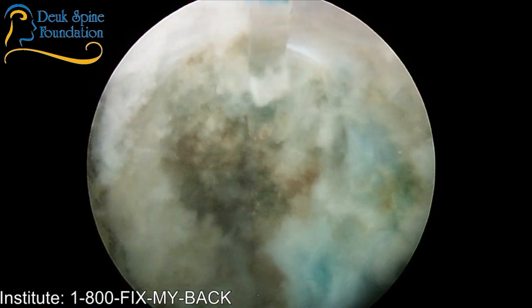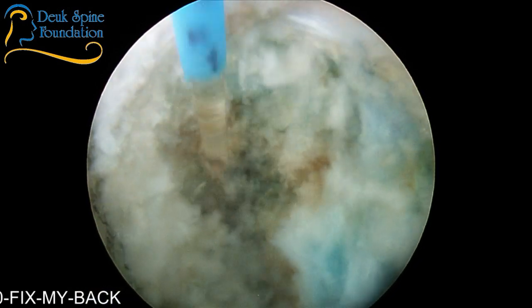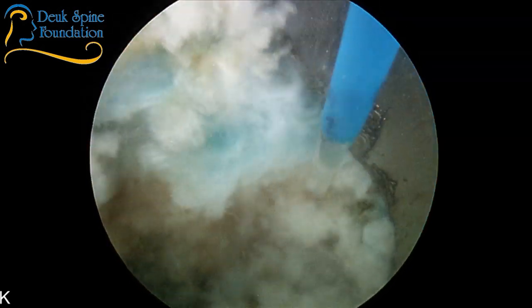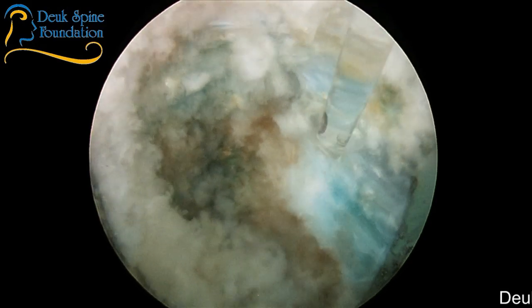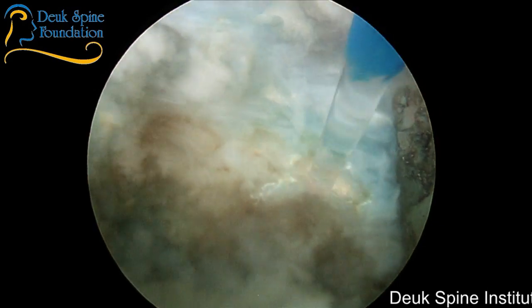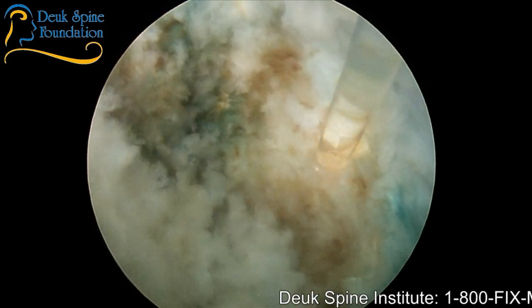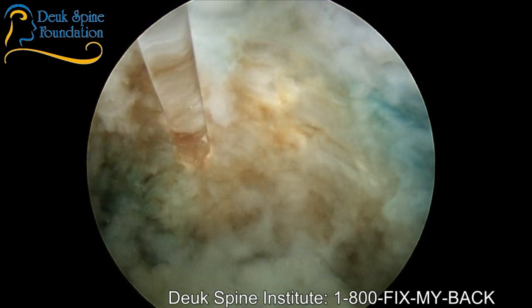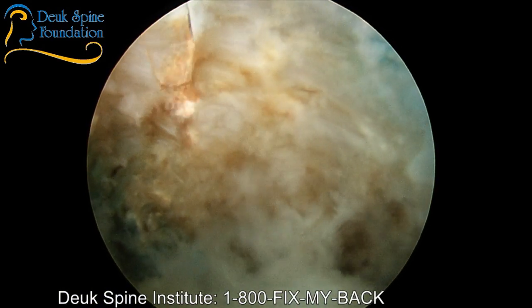And that takes time. So I'm really just zapping away with a laser at the herniation, kind of the base of the herniation right now. And I'm looking to the outside laterally, because you've got to make sure you deal with the lateral part of the herniation. That's the part that goes to the side, because you can still hit the nerve out to the side. And so this is all scarred up herniation right here. See how it's white and thick, collagenous. It's like tendrils of collagen from chronic inflammation.